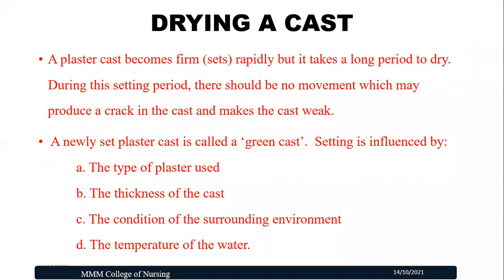Next, we'll look into the drying of the cast. This is the important care that the nurses should understand after application of the cast or POP. Because once after applying the POP, the patients will be with the nurses. So we need to understand how this cast is getting dried, what is the process, and how to take care of the patient.